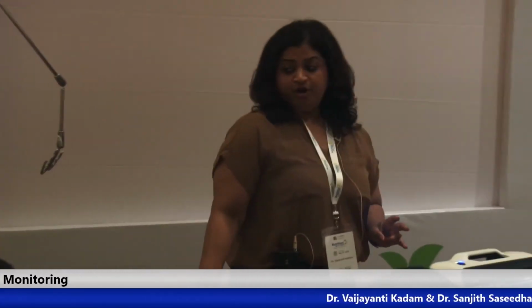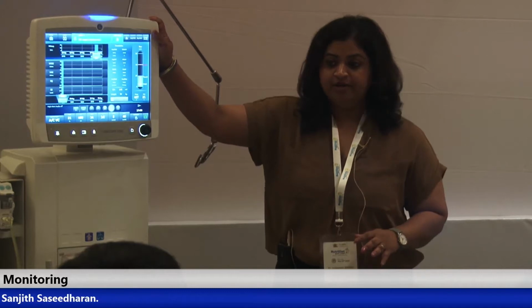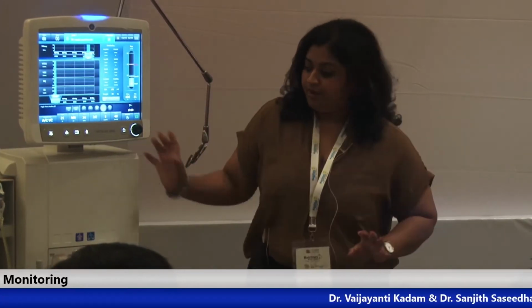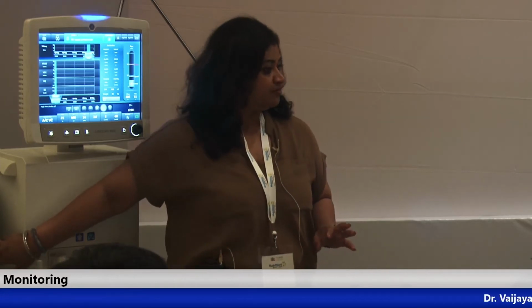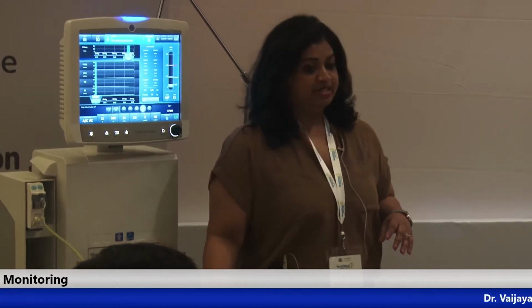So what is this machine? This is a ventilator, a GE ventilator. The ventilator does not give us anything, but there is a box you can see beside it. This box is a module, called an E-COVX module. Can you all see from there? This box, the E-COVX module, is going to tell us the energy expenditure.